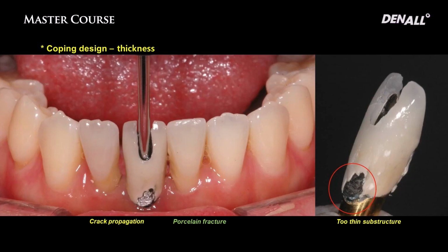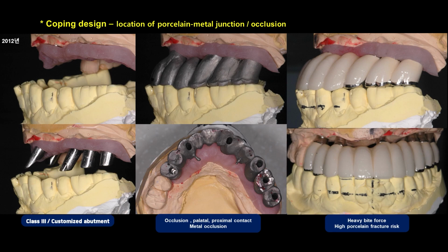Thick porcelain breaks, but thin porcelain also breaks. For smaller space areas, the axis for placement or the abutment implant diameter inevitably results in making it thinner. But with the porcelain buildup and various processes, a thin structure cannot give enough support, so cracks could be the result, and after delivery, discoloration or fracture could occur. So a thin substructure should also be avoided.